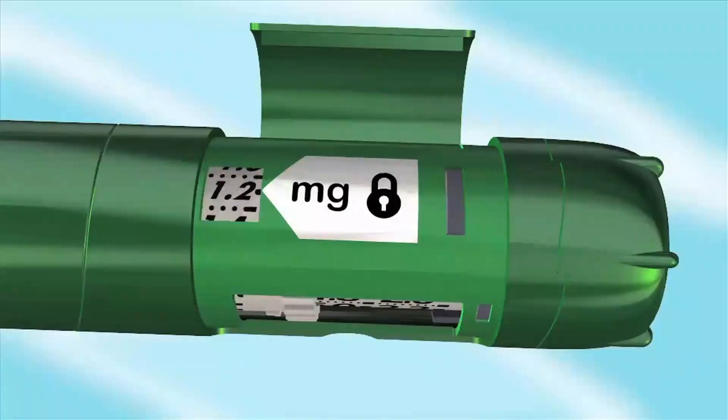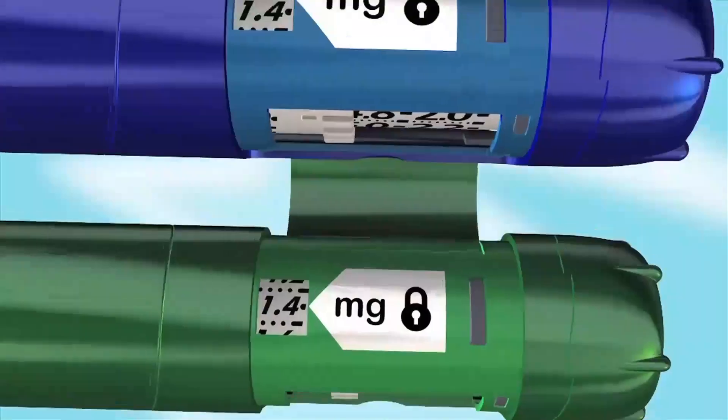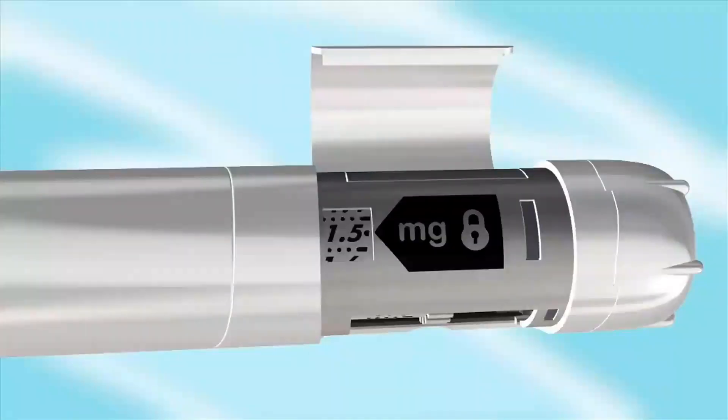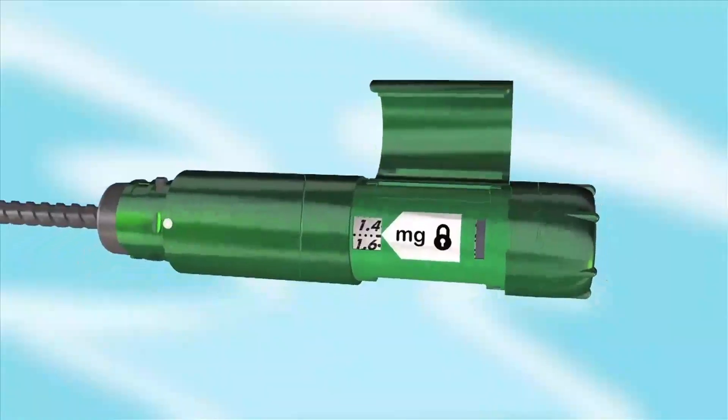To set your dose, ignore the numbers next to the wheel and instead look through the window with the lock symbol. This window shows you the dose you're setting. Stop turning the wheel when your dose appears in this window. If your SurePal is green or blue, the dose goes up by 0.1 with each click. Uneven numbers are not shown but are indicated by dots and a dash between the next highest and next lowest numbers. When the window shows your dose, close the memory lid.